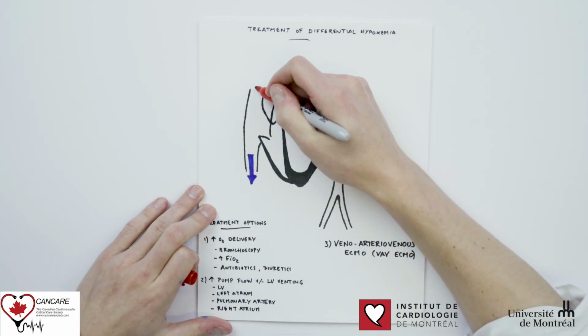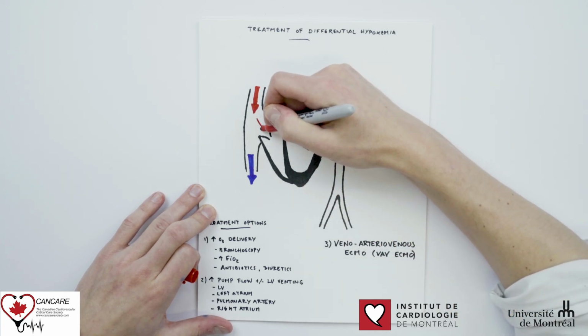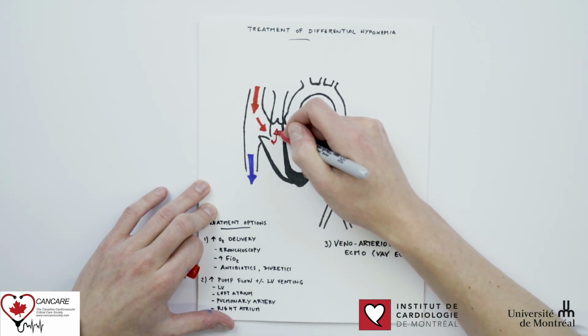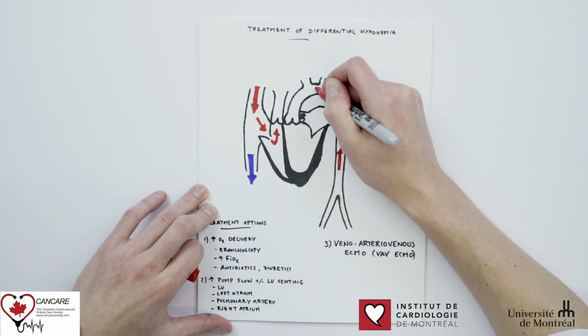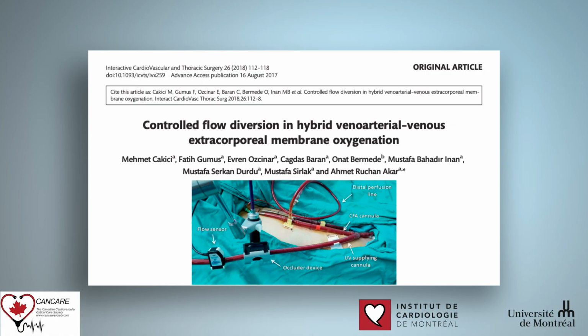Using this configuration, fully oxygenated blood can be delivered both to the lower body and the pulmonary circulation. Flow adjustments can be made in order to modulate the amount of blood going through each part of the circuit. Eventually, the Veno-Arterial-Venous ECMO can be used to bridge a patient to a more conventional veno-venous ECMO once the heart has fully recovered. An in-depth description of this specific strategy can be found in the Interactive Cardiovascular and Thoracic Surgery Journal. On the image below, notice the occluder device on the inflow cannula, allowing gradual weaning of the arteriovenous ECMO.